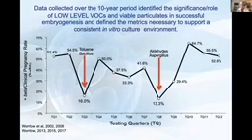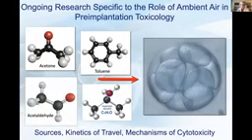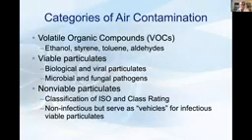So it was really this negative data that helped us to learn more and define what level of VOC is truly necessary, what level viables and non-viables. It also led to ongoing research that we're conducting to this day, looking at what VOCs are common to IVF laboratories, what are some of their concentrations, how do they travel, what are their kinetics of travel, say from the gaseous, the air environment in your laboratory, through the oil overlay, if that's being used, into the culture media, and then into the cell or the embryo. And once there, what are the mechanisms of cytotoxicity? So this work is fascinating, and we're continuing this to this day.